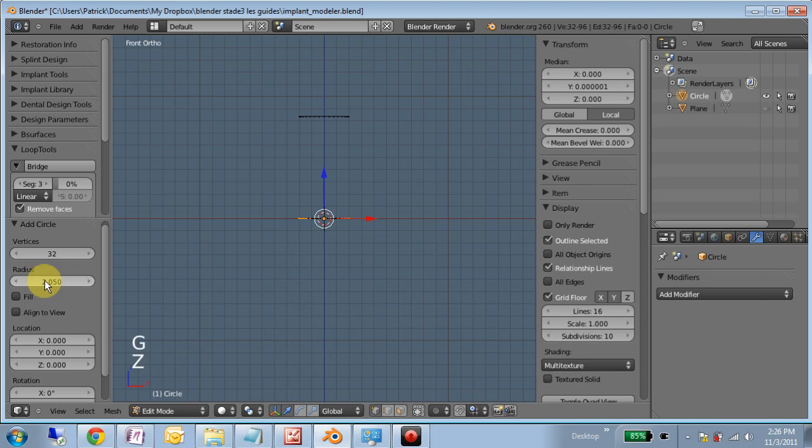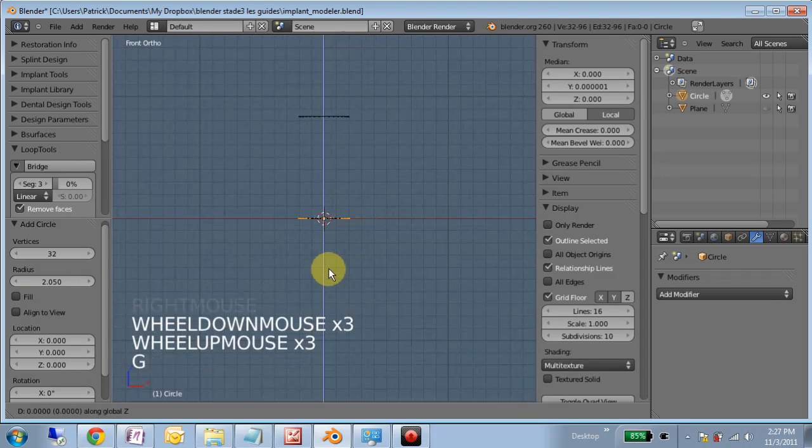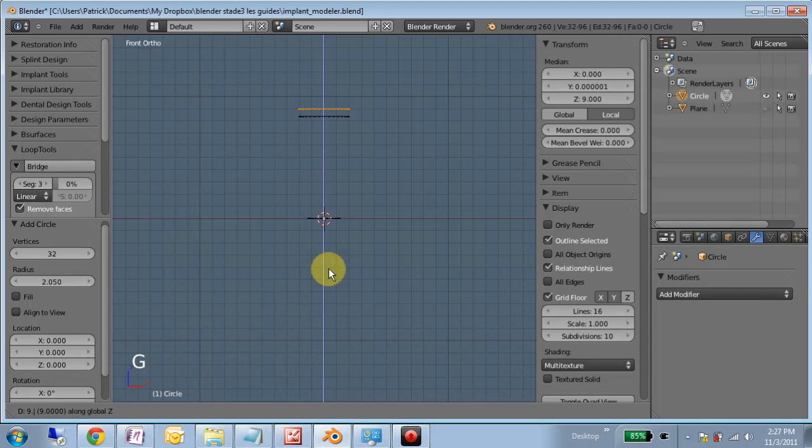G, Z, 9.63. Oh, sorry, I have to be over here. G, Z, 9.63.